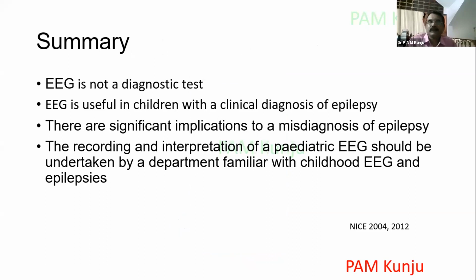So to summarize, EEG is not a diagnostic test. EEG is useful in children with a clinical diagnosis of epilepsy, and there are significant implications to a misdiagnosis of epilepsy. In the recording and interpretation of a pediatric EEG, it should be undertaken by a department familiar with epilepsy and EEG. I think I am concluding here, and I took only 16 minutes. Okay, I think I'll conclude here.